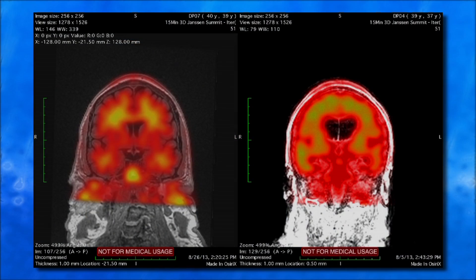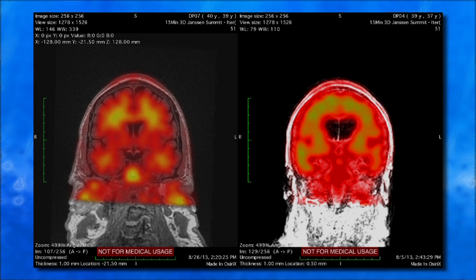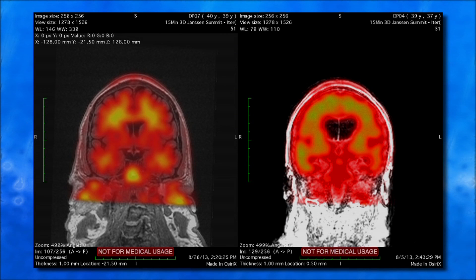So the images you're looking at are really reporting not only the shape of the brain and the size of brain structures, but also the extent to which this amyloid protein is present. You can also see that the individual on the right not only has increased deposition of the bad protein, but also has enlarged ventricles. Ventricles are normal, but having them of this size suggests this patient's brain is actually shrinking much more, because those fluid-filled spaces are expanding to take the space of brain tissue that used to be there.